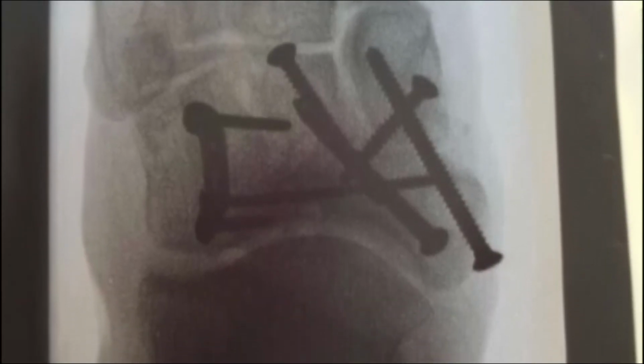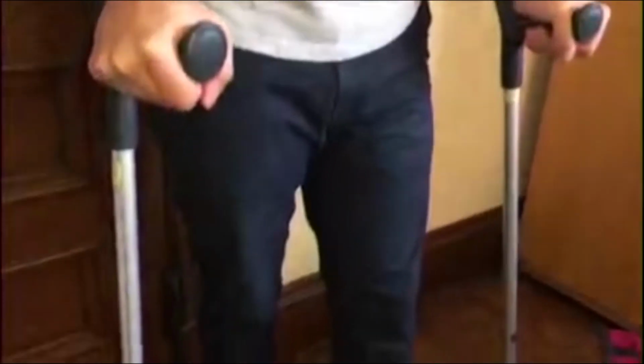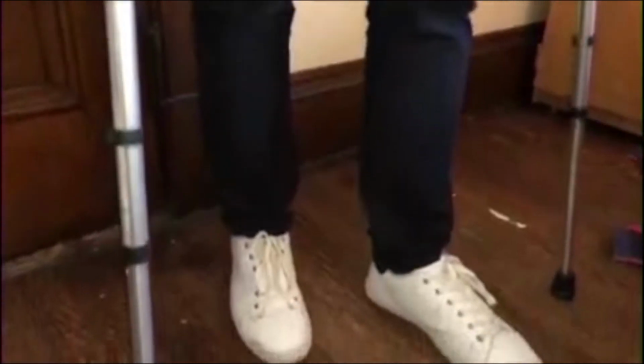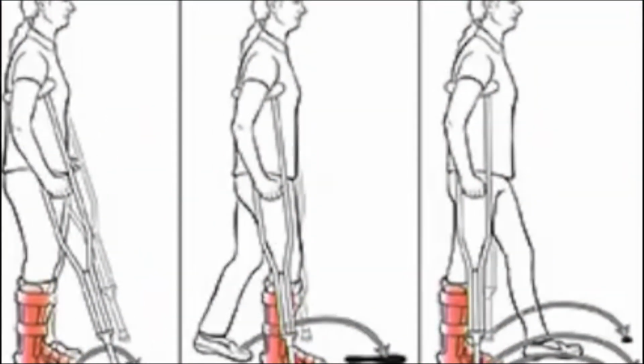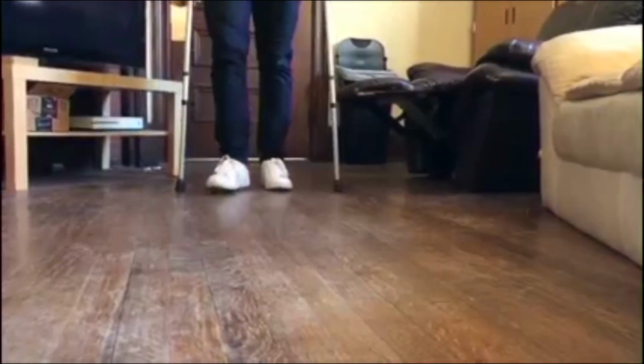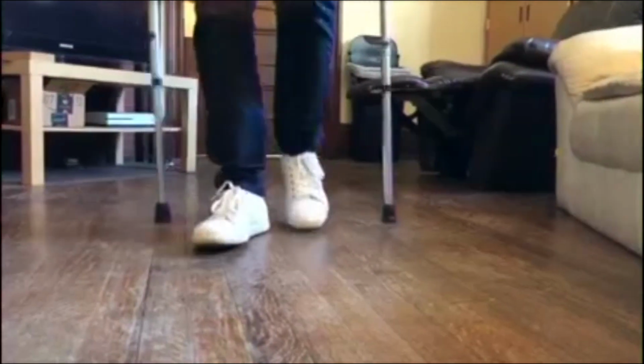For optimal healing following critical bone injuries, it is necessary to gradually start putting weight on the affected lower limb and progress to full weight bearing over the course of the recovery period. Orthopedic surgeons instruct patients to approximately apply a percentage of their body weight onto the affected leg, depending on the phase of rehab. Most patients find it difficult to know the exact amount of weight they're loading onto their limbs, and thus end up overloading the injury.